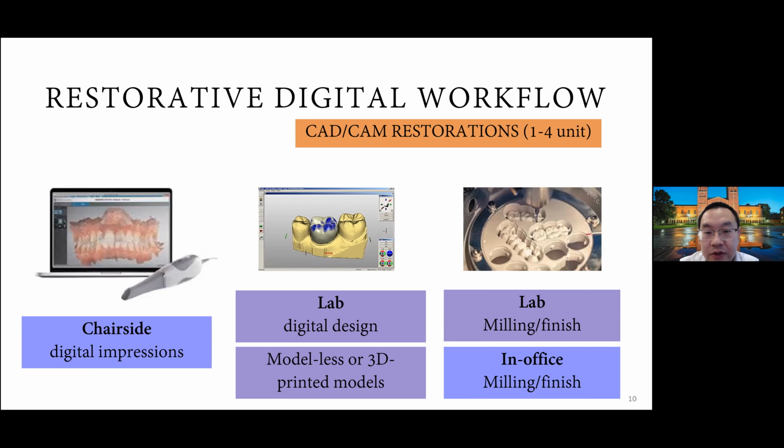So if you use that to adjust your bite, adjust your occlusion, which shouldn't need too much adjustment, but mainly for proximal contact, that's a good way to have a printed model where you can pre-adjust your proximal contact before trying in on the patient, thereby saving you some chairside time.